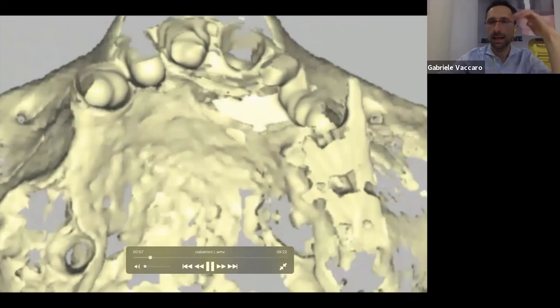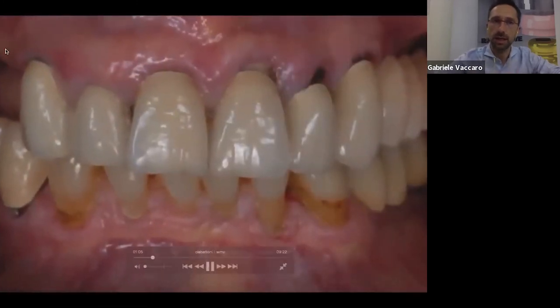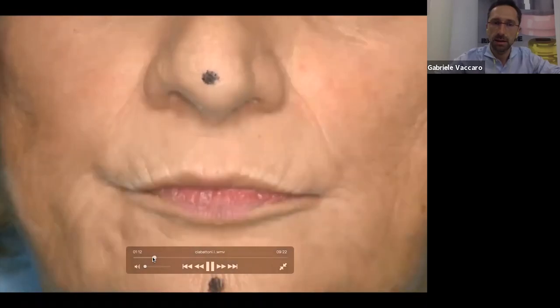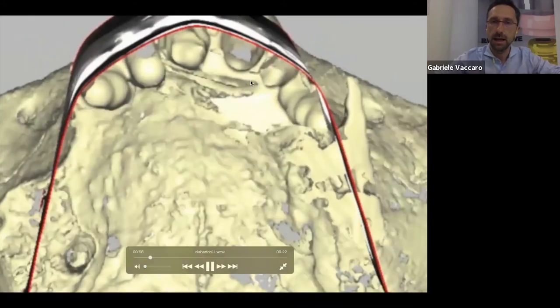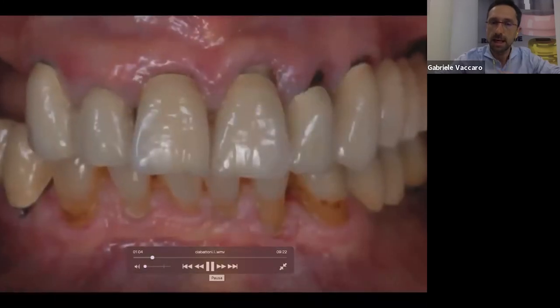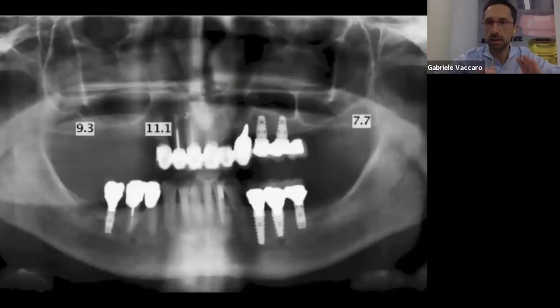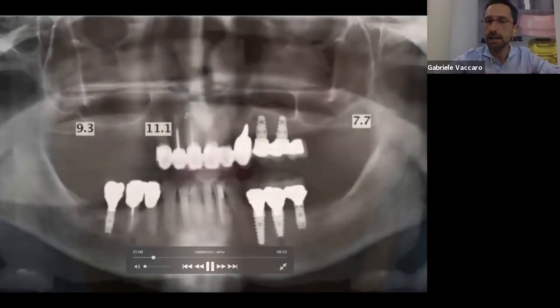The impression tray is a special impression tray, as you saw, because it has mounted teeth. Because with one step, we have to take the impression of the implants and the position of the mouth. As you saw before, there are two implants in the mouth of the patient. She has two implants put in the past, placed 10 or 15 years ago by another dentist. We took advantage of this because we had two implants ready in the mouth. We didn't know what implants were those, but we put two equator over this, and so we treat them exactly as if they were implants put by us.